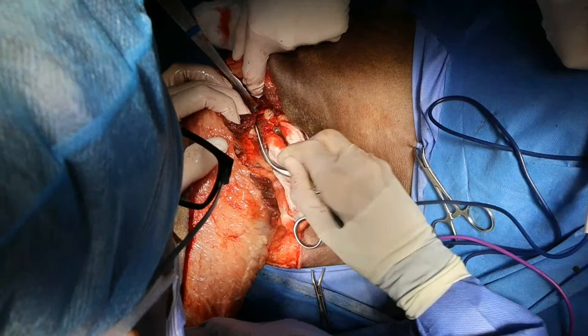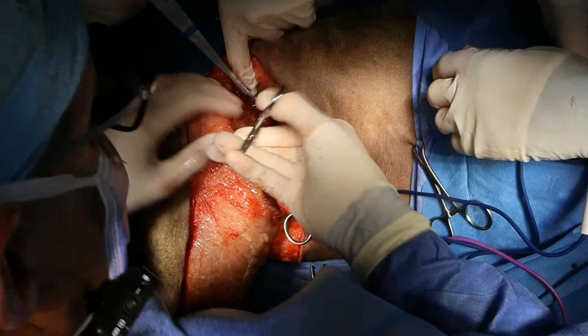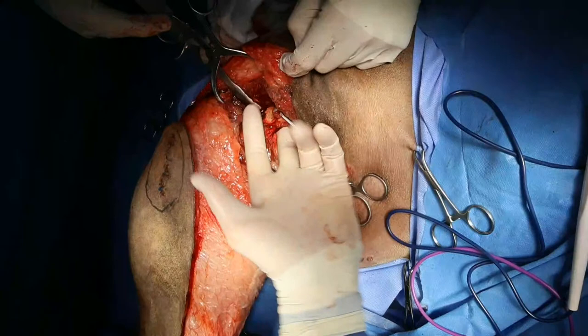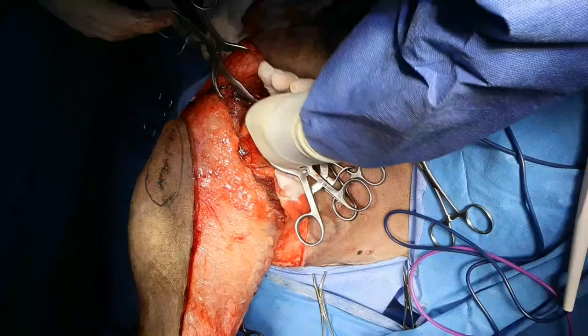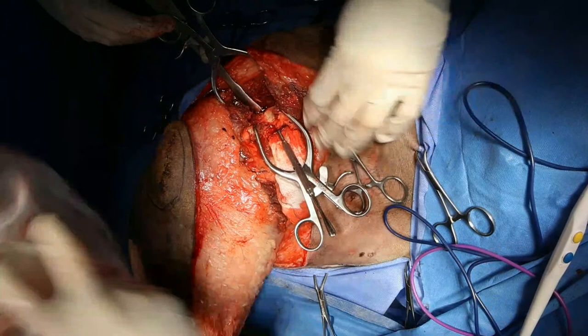I'm just making sure, so there's sciatic nerve there. You can see it twitching as I, right there. And we'll get another lap sponge in here. Yeah, we'll have a few. Okay, so that's a really nice view of the ilial wing. Hopefully you guys can see it. And I want to go as far cranial as I can. So I'm actually palpating sacrum right there. Did it touch? Sorry. So go ahead and split that ilial wing.